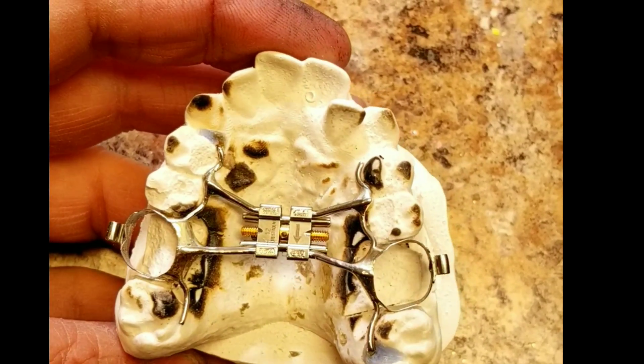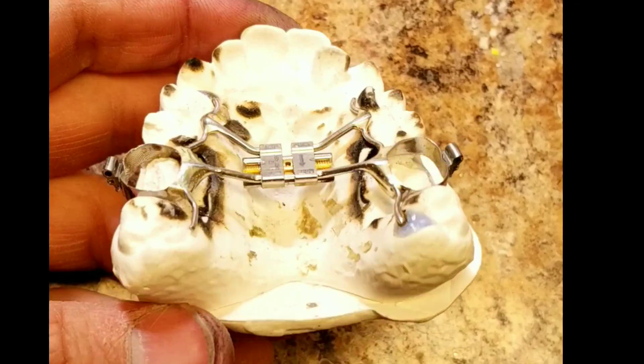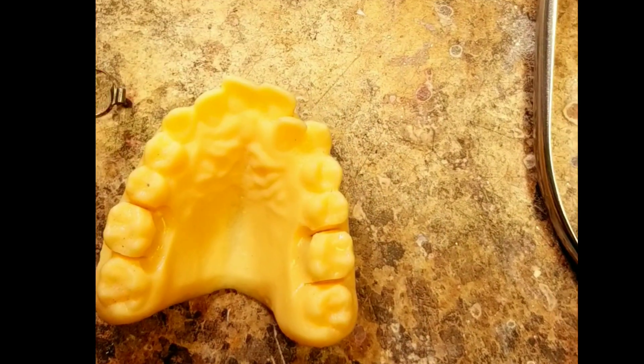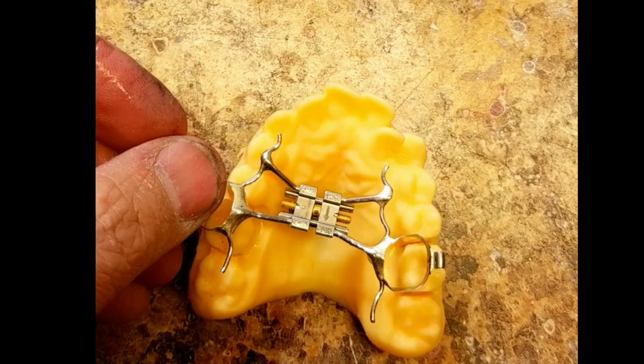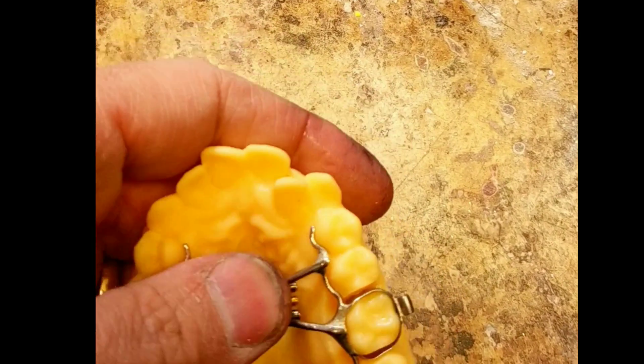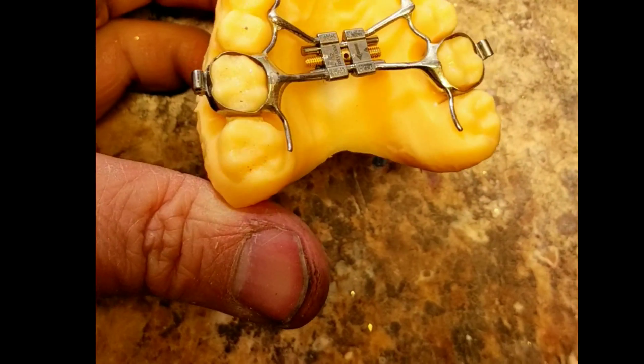I'll show you a clip: first I duplicate the model, then pour it up in stone. I make the appliance - in this example I made a Hyrax expander. Then before I deliver the appliance on the 3D model, I actually cut out the teeth and reseat the new expander on the 3D model. I make the soldered appliance on a duplicated hydrocolloid model, do a final seat, prep the 3D printed model, and make sure the Hyrax seats on it properly - then it's ready to send out.